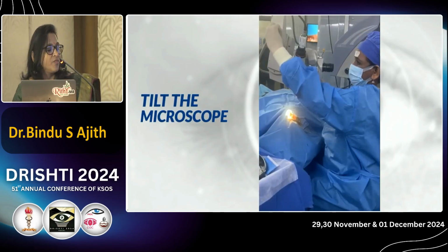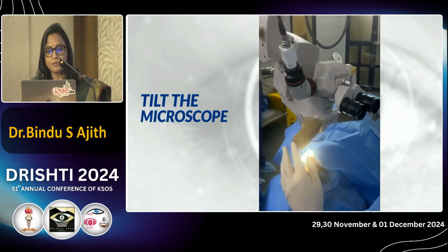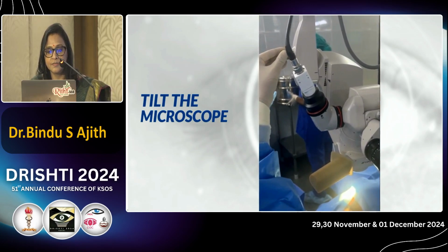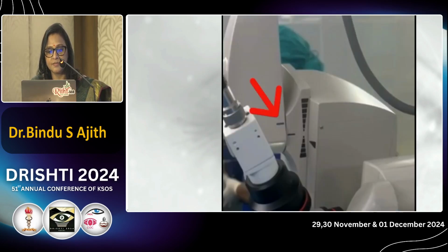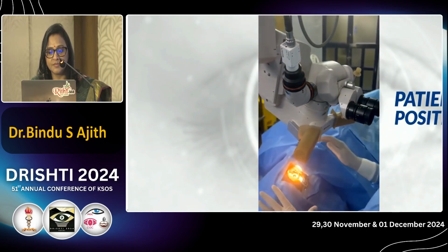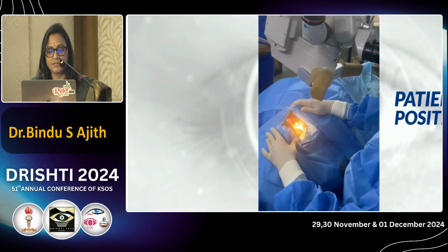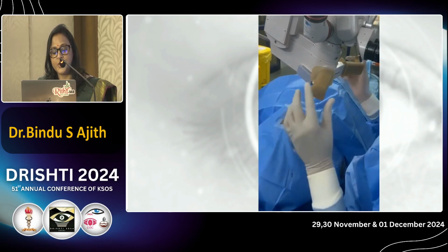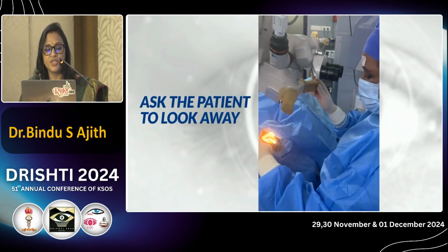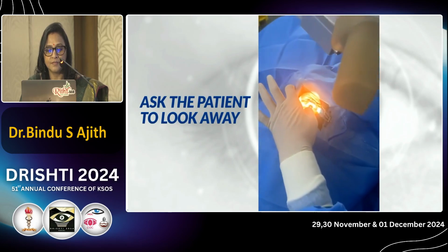This is the process of tilting the microscope, preparing yourself. Tilt the head of the patient away from you and also ask the patient to look away.